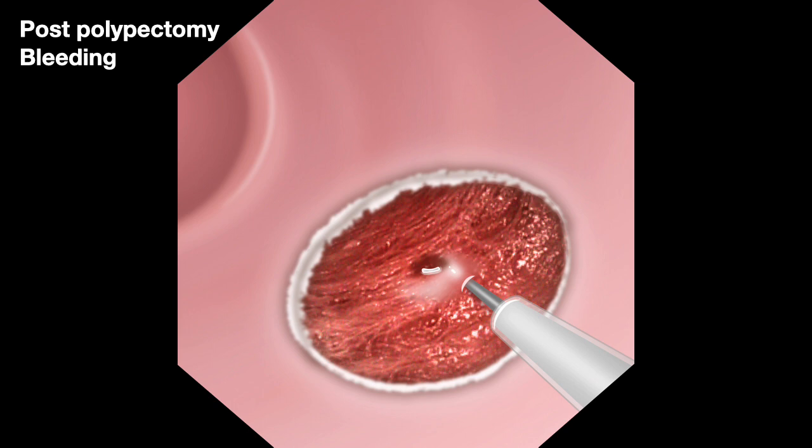Because the effects of epinephrine are transitory, we should make sure that we apply additional therapy like a clip to secure the bleeding vessel.